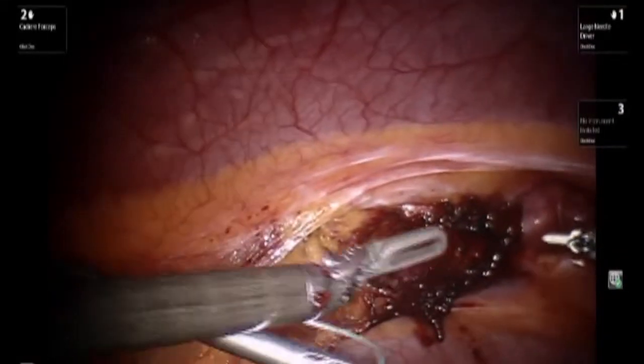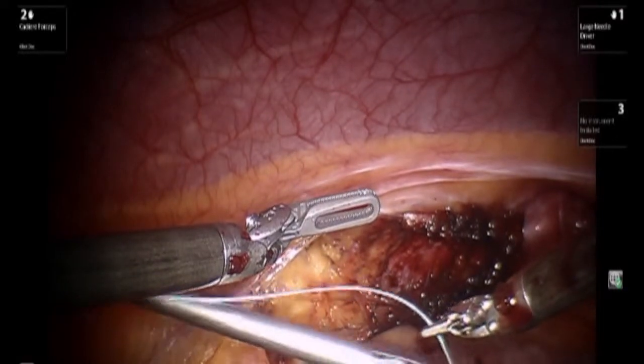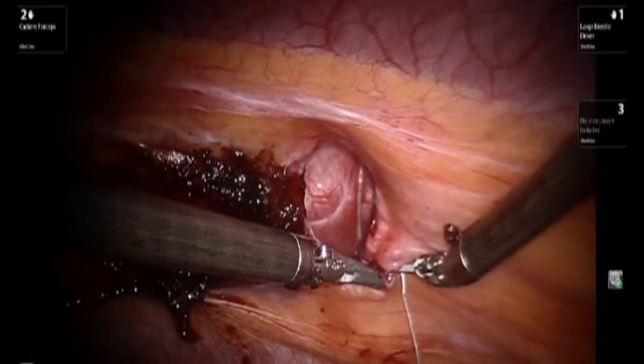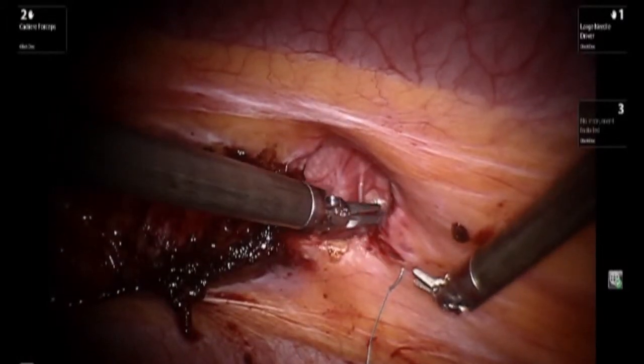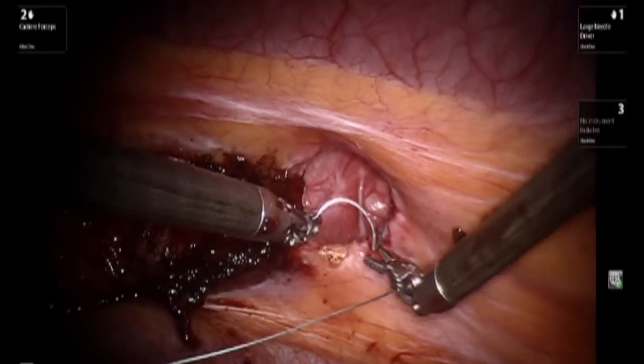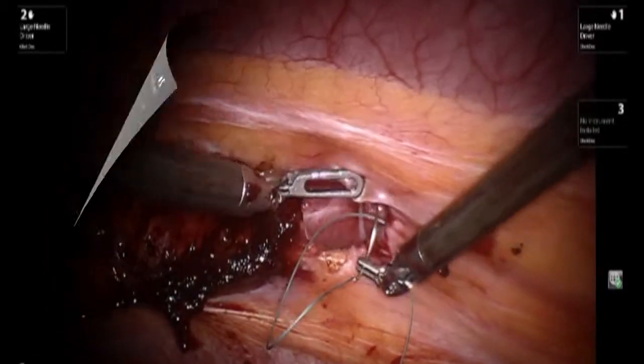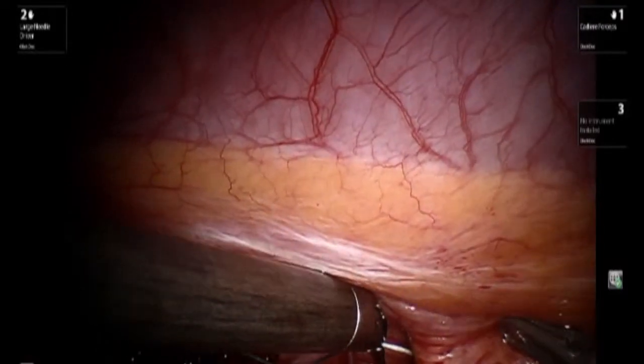At this point the robot is brought in and using two robotic instruments — a cauterizer and a needle driver — we proceed to close the fascial defect by placing multiple figure-of-eight sutures. The stitch being utilized is a zero-Ethibond suture.